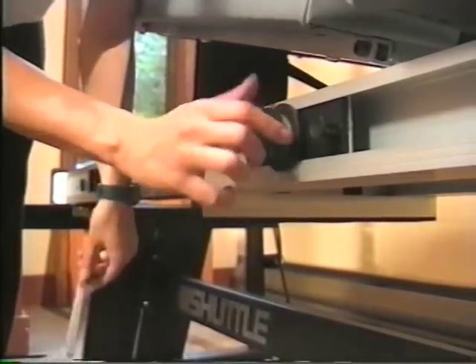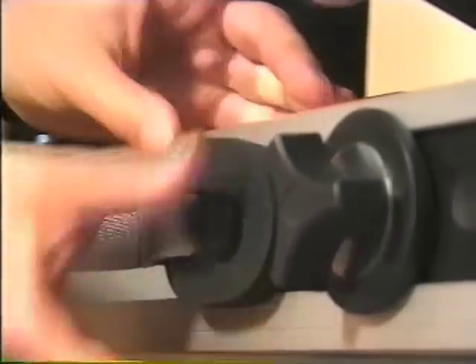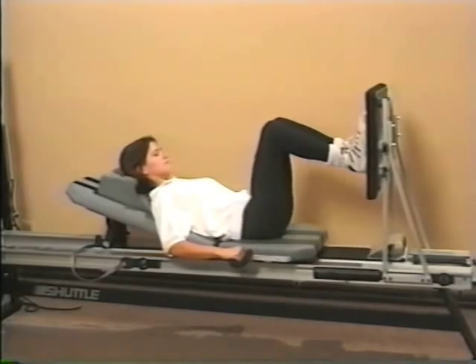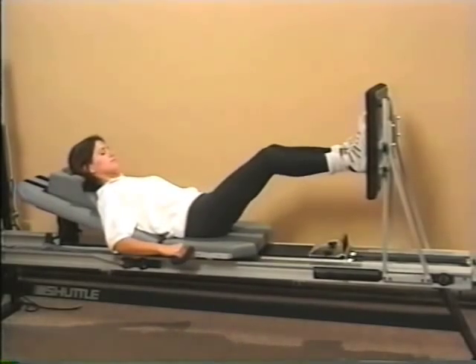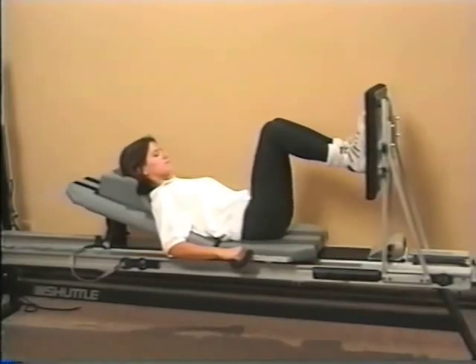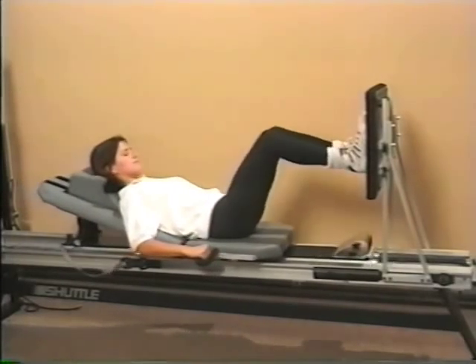This range of motion control, or ROM control, limits the user's stroke length or distance traveled on the shuttle. Once initial flexion and extension are established, you can use the ROM control for patient-directed therapy. For example, use it with an overly eager athlete who tends to be a little too aggressive. If you're in a very busy facility, this also frees you to attend to other patients.